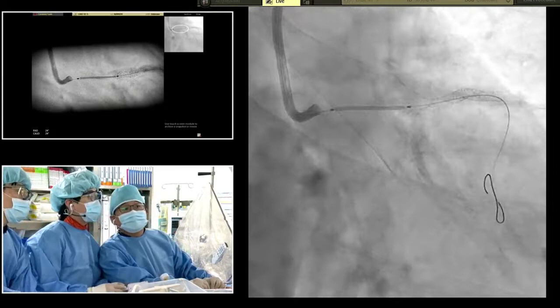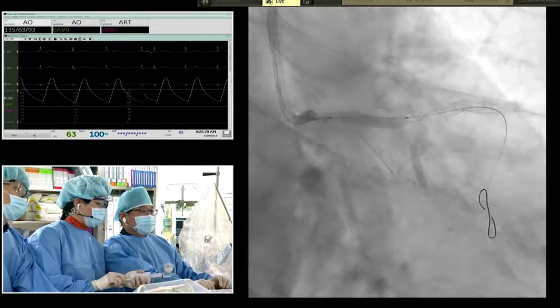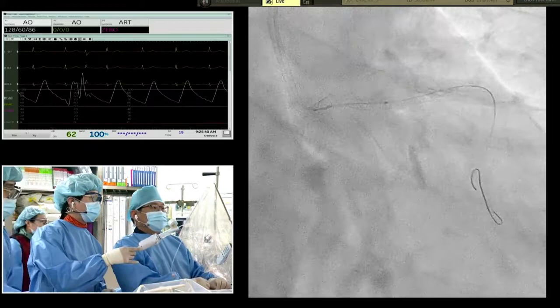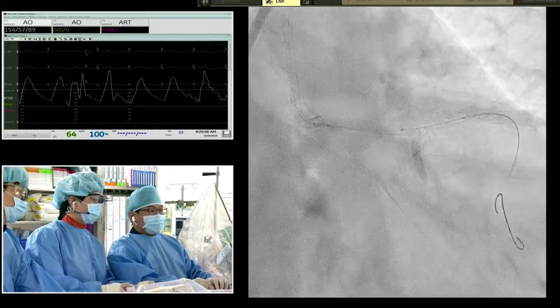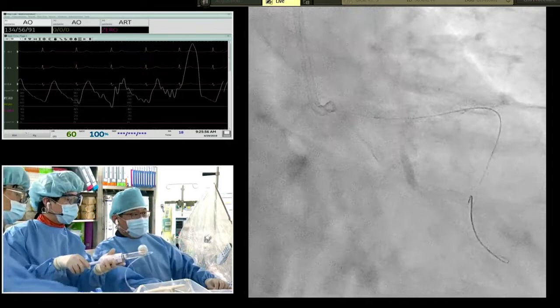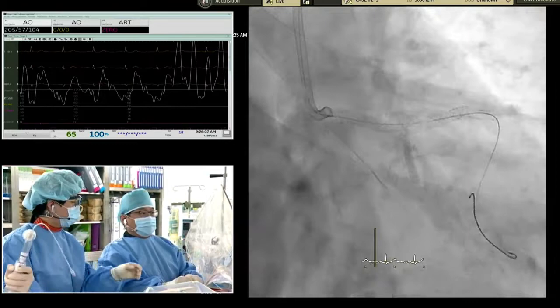Okay. Inflation. Put that already. Deflation? No, they didn't. He inflated already. What kind of stent do you use? Do you have any preferred stent for a severely calcified lesion? No, I think every stent would be similar. Ready? Fortunately, the circumflex is good. Yep. I try to make minimal overlap, with a small geographic miss outside of the left main.